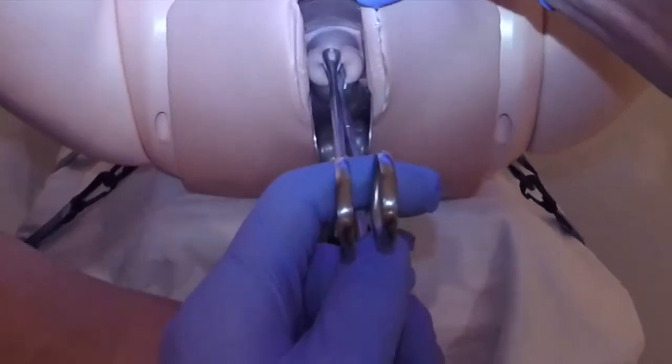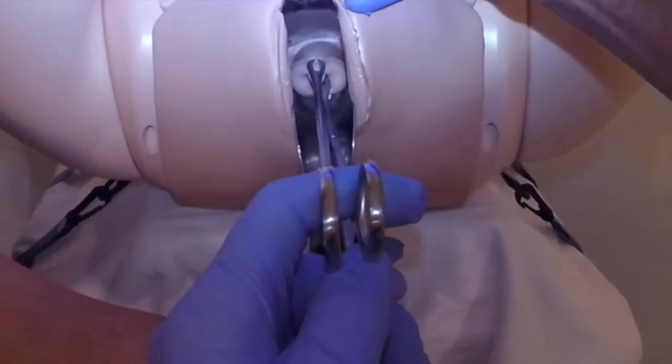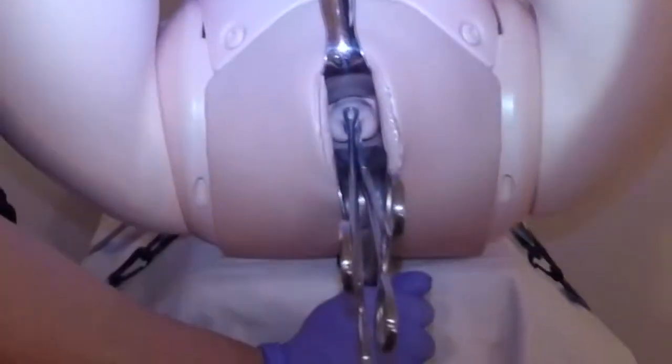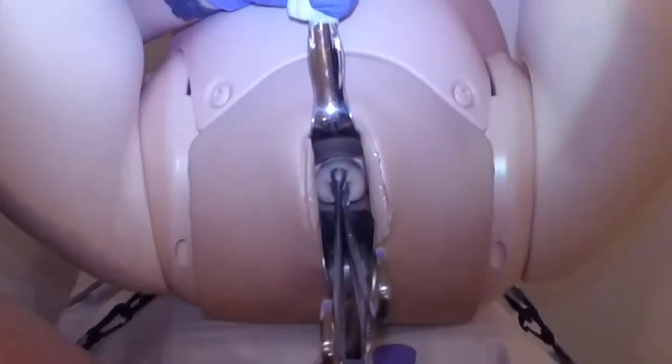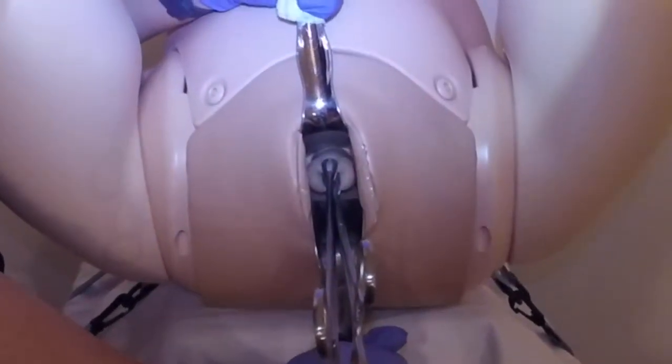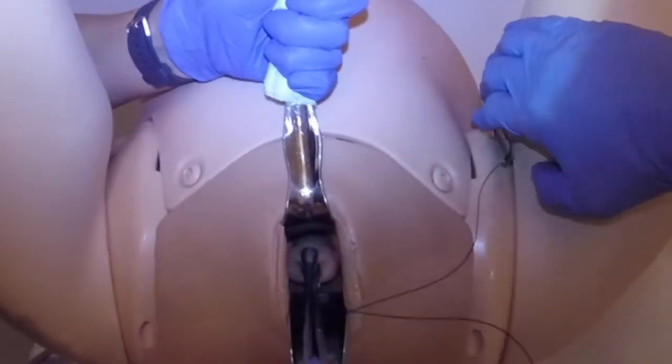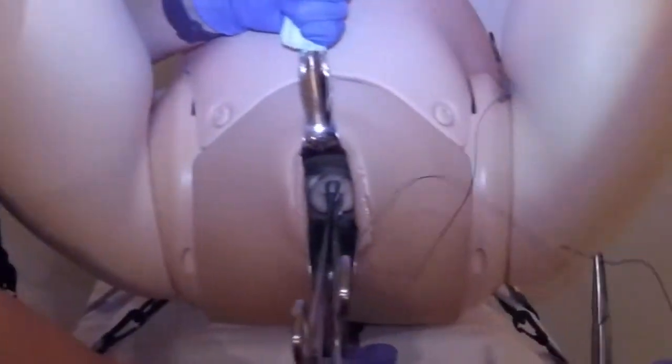Hold it back by pressing down and up. My patients will have been to the toilet just before they walked into theater, and they'll have a light anesthetic, so I'll only do an in-and-out catheter at the end. I have a clip on this end which I'll normally clip onto the drape.